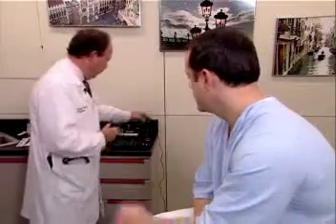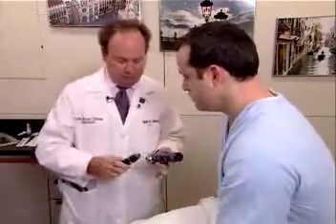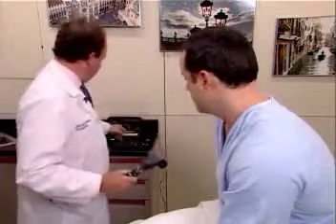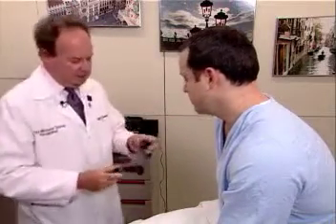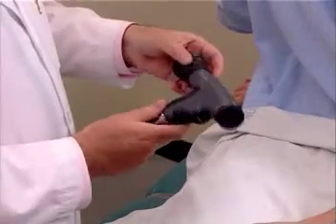The other advantage to the panoptic is that there is a greater working distance between the patient and the examiner, and I'd like to demonstrate it right now. The panoptic ophthalmoscope works with any of the standard 3.5 volt handles. This is the head, and this is the eye cup, and I will demonstrate its use in just a moment.